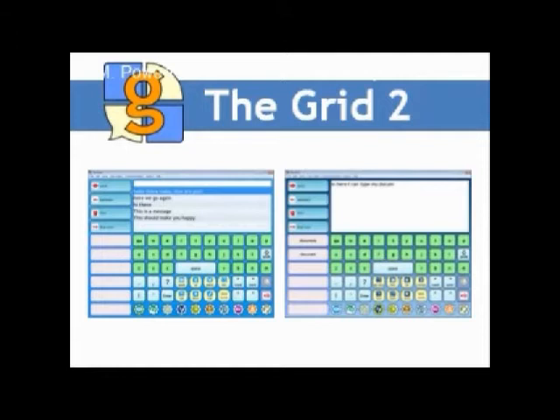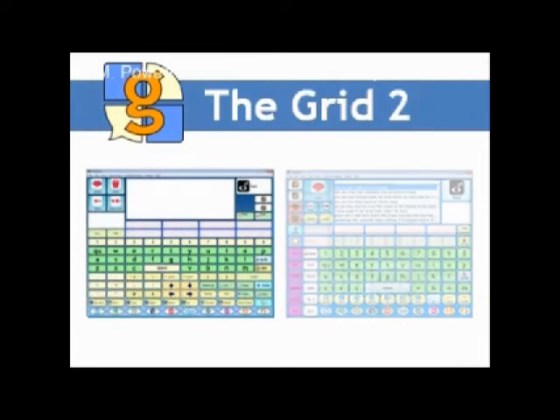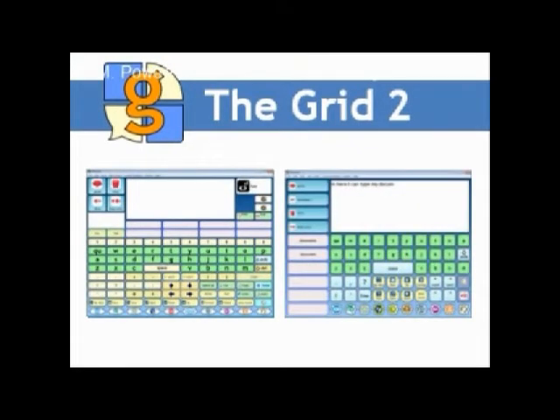The main issue I had was cell sizing. Nice and big for easy selection, but it severely limited the number of cells available in a grid, which meant having to continuously jump to other grids frequently for commonly required cells. So I set about shrinking everything to the minimum usable size and filling the gaps with all the useful cells from 4 other grids. This process was ongoing for a couple of months after I started using the system regularly, replacing infrequently used cells with those I found myself jumping to other grids for.